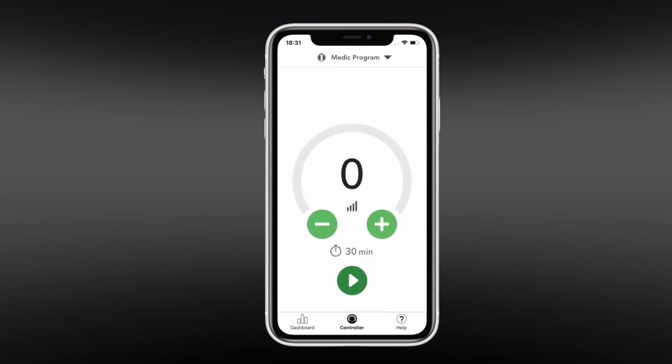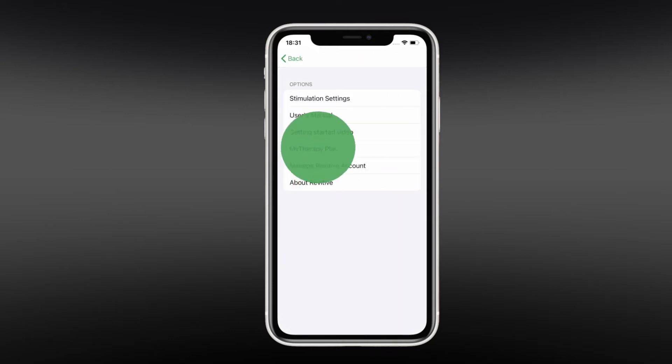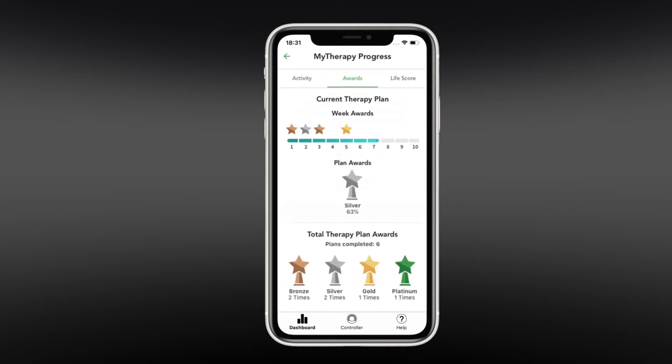Pairing the smartphone app with your device unlocks many benefits. For example, the app allows you to control the device, select different therapy programs, create new therapy plans, track your therapy plan progress and much more.